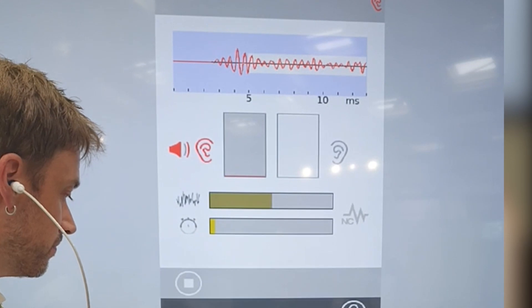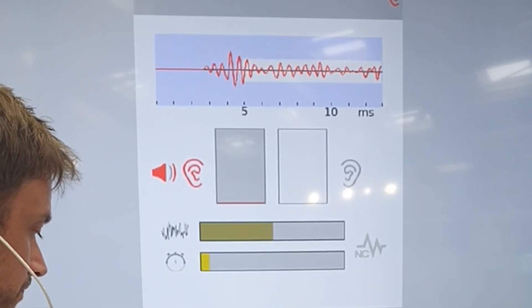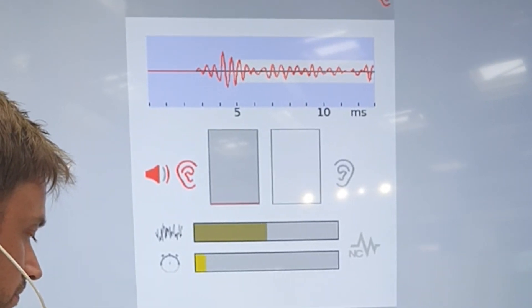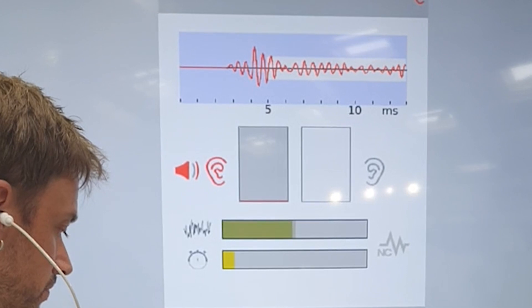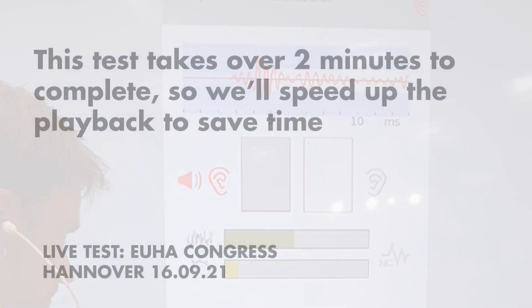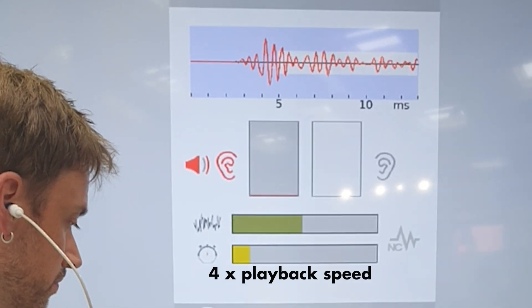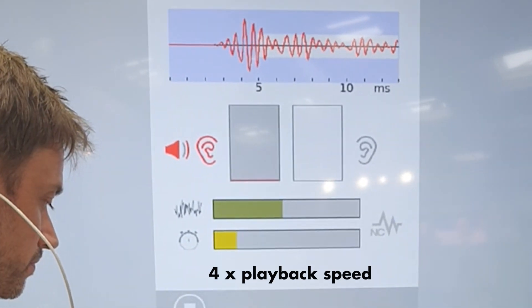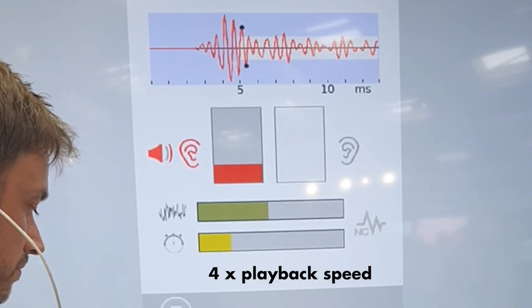You can see we've got a waveform building up — noise levels are pretty good at just under half. At this point in the video we're speeding up to four times playback speed, and you'll notice the top waveform looking more defined as we take more averages.